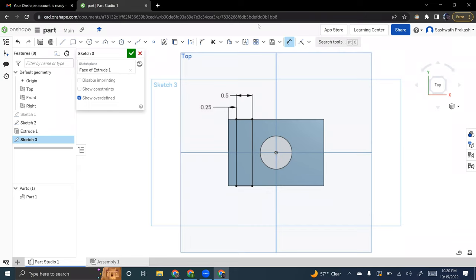Good. Now we're going to click the outer two edges of the rectangle and make that 0.5. No, you're going to make the width 0.5. So you can click that one, going to the right edge of that same one, good. Drag all the way up or down, whatever you want, and then make it 0.5. There you go. Now you've made it.